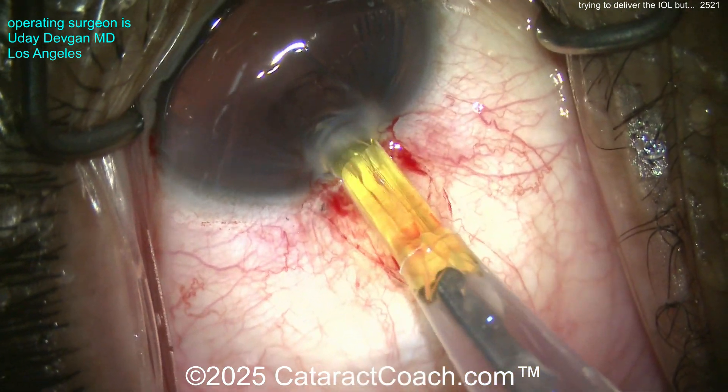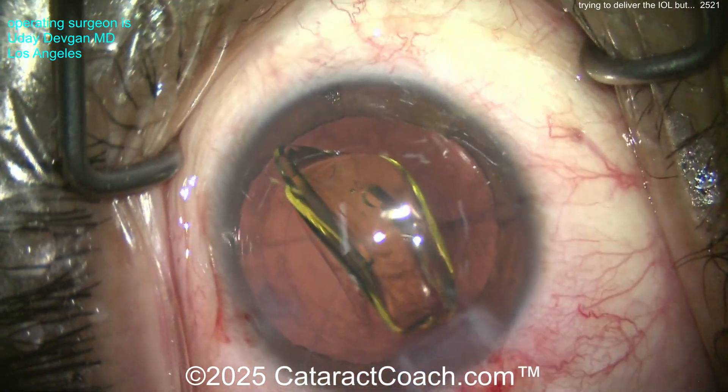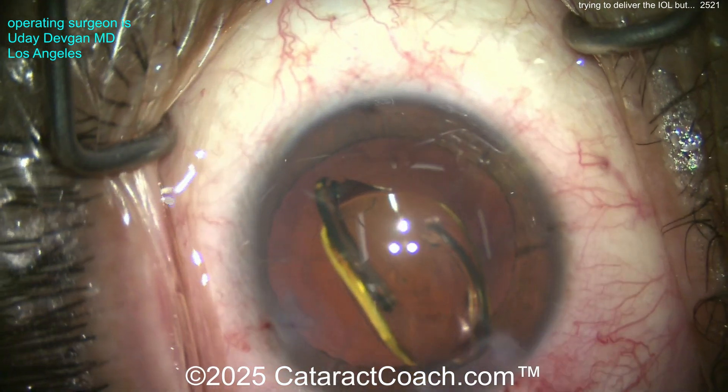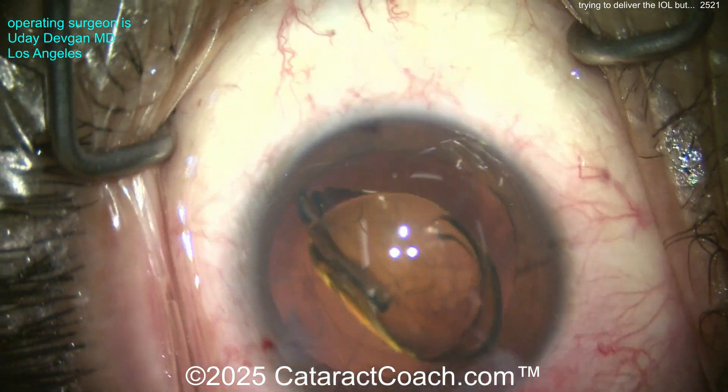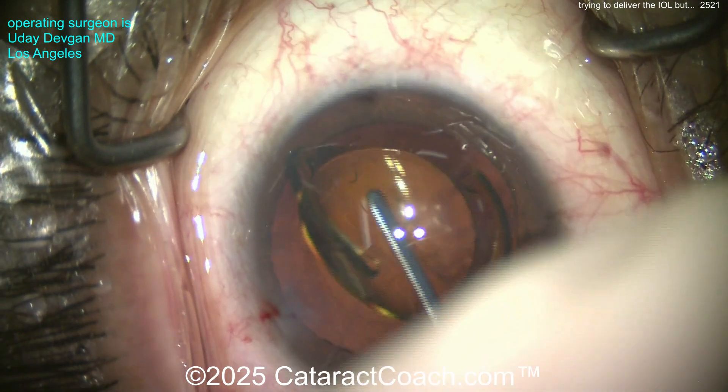Now look — we can get the lens in, and I'm going to be a lot more gentle here. As soon as the lens gets in the eye, put the eye back in primary position. There we go — get that delivered in there. Whoosh, okay!